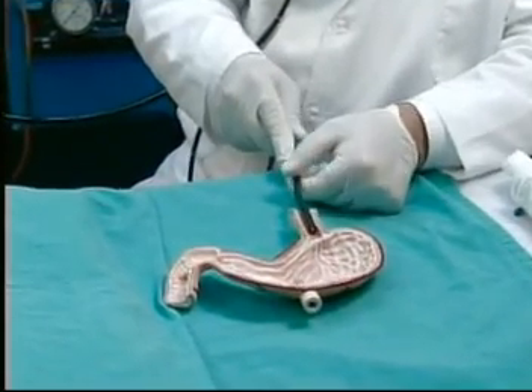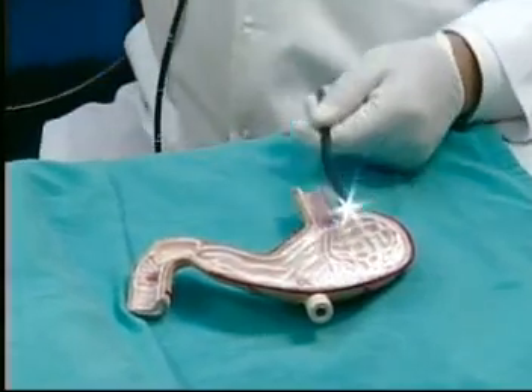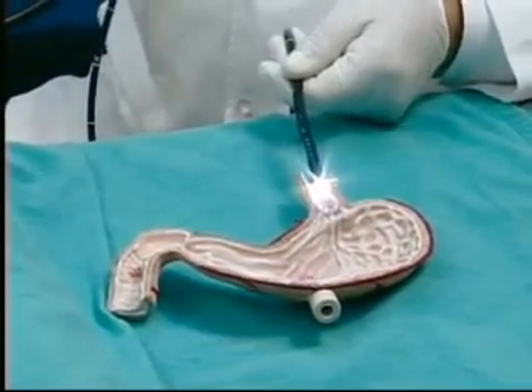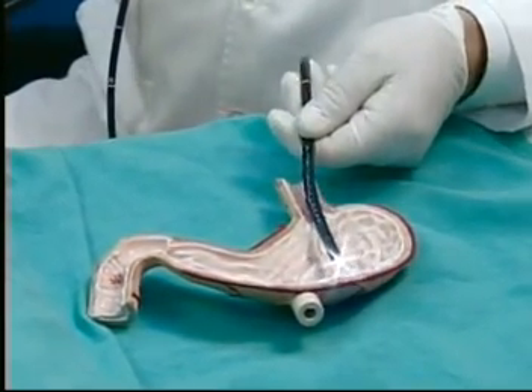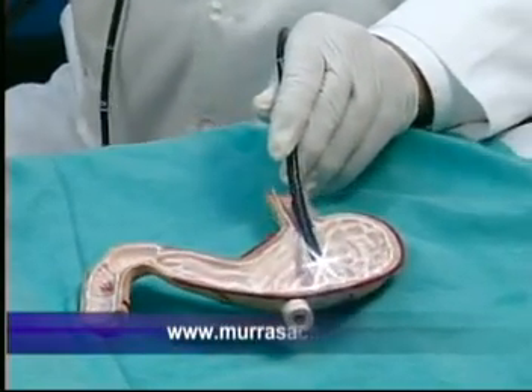I am introducing the device. As it is introduced with the light through the esophagus, it is slid with the lubricant and goes through the esophagus. The equipment is very thin. As you can see, the apparatus is extremely thin and flexible in all directions.